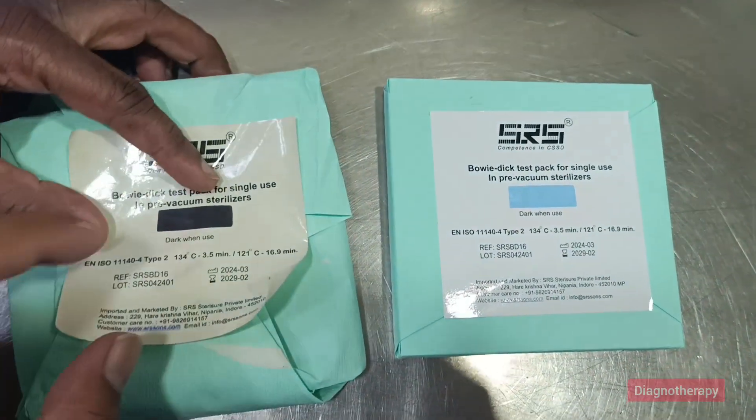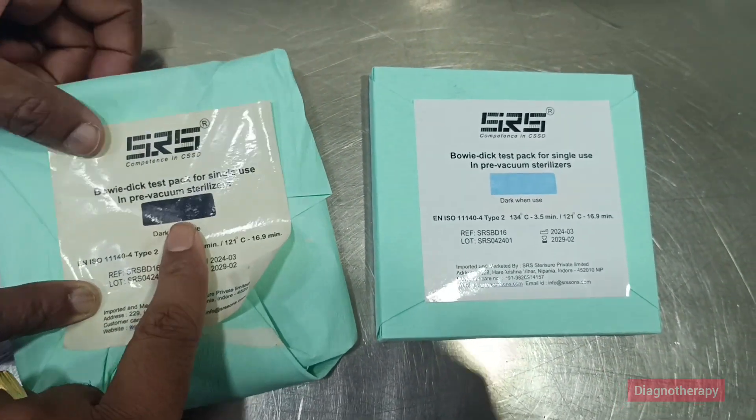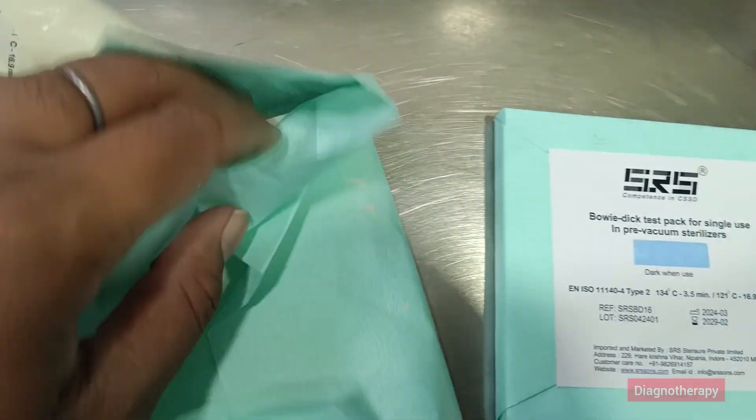On the left we have a black strip — this has been used in the autoclave, so it is sterile. On the right side you can see the previous color, which was blue.